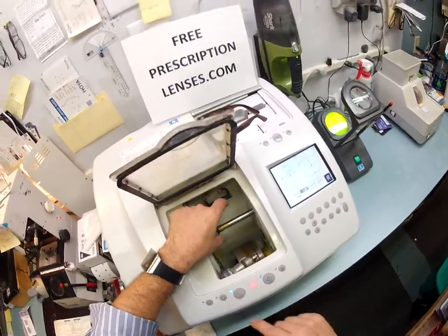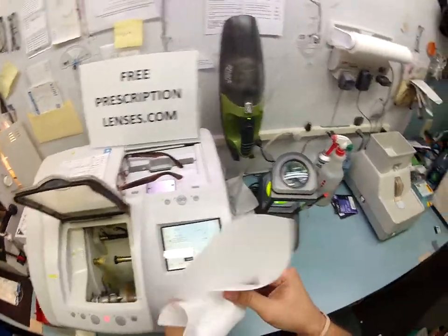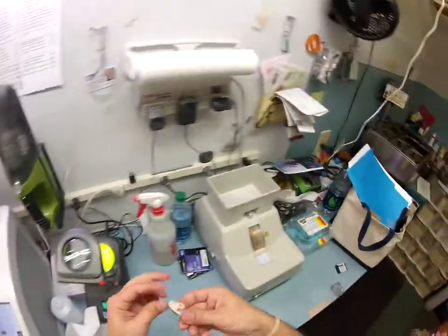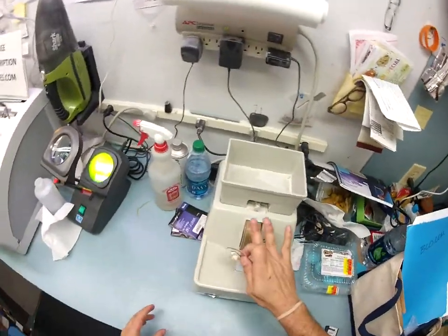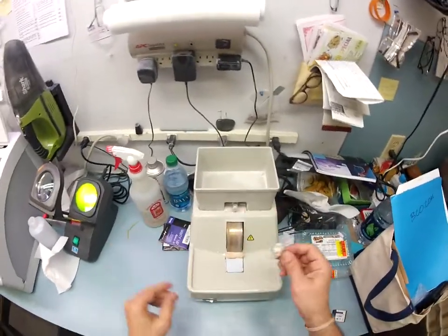My patients love to stand next to me while I'm cutting their prescription lenses, and they watch all of this. They stand right here and watch while I do this, but since you can't be in my lab tonight, I'm going to bring my lab to you. Now, what I've done, first things first, is dry your lens off so it's not slippery, but you still have a little bit of rough edges, so I want to use my handstone, which is completely flat. I can put my hand on it while it's running, and while it does get dusty, that's about it.